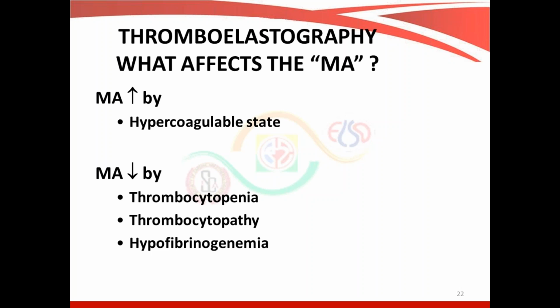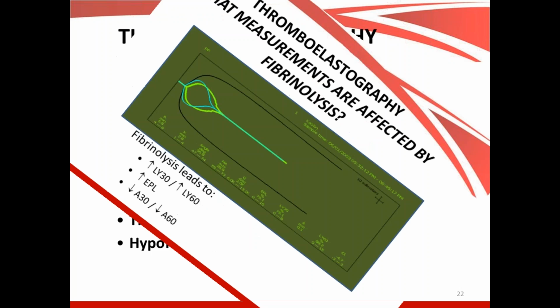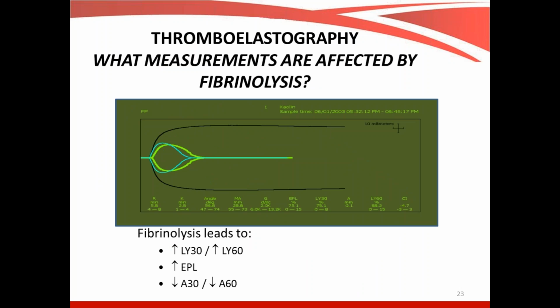And to market against this TEG, the ROTEM came up better. We'll talk about it. They started to put INTEM and FIBTEM together, and these became the best markers. So this is how they scored over TEG. So this is how, as I was saying, the normal old classical TEG looks like. There is a fibrinolysis here.